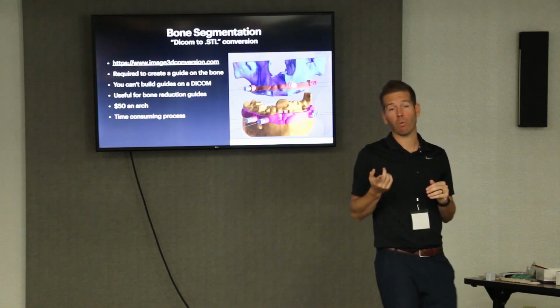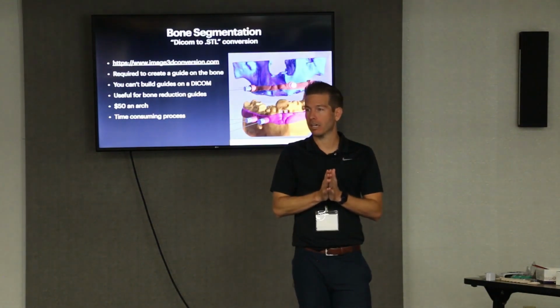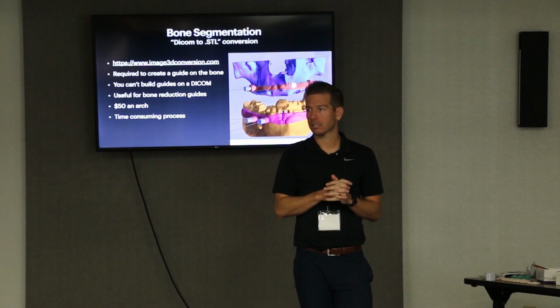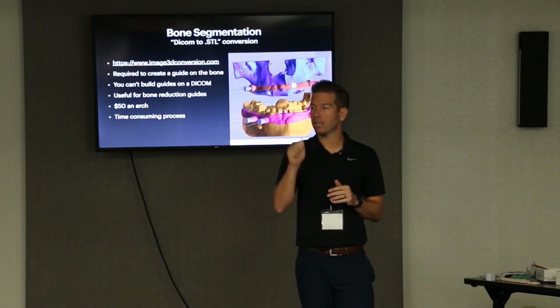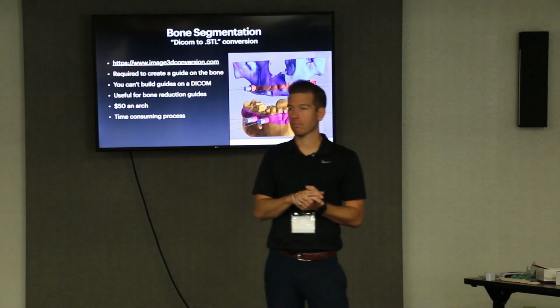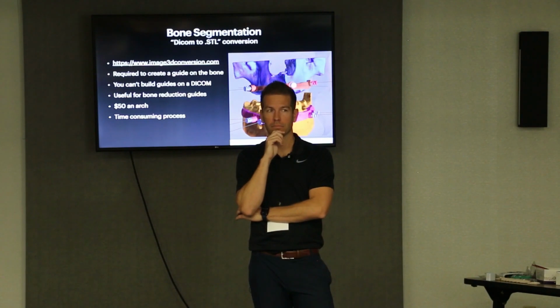And I've been doing a lot more guides too, James, quite a few. Where you can't just trust the guide, because the guide will push you. You can go buccal or lingual really. If it's a thin ridge, you almost have to start it like a pilot punch. It comes with that little bone flattener, you know, the Blue Sky kit. You can take that down first and flatten it real quick.